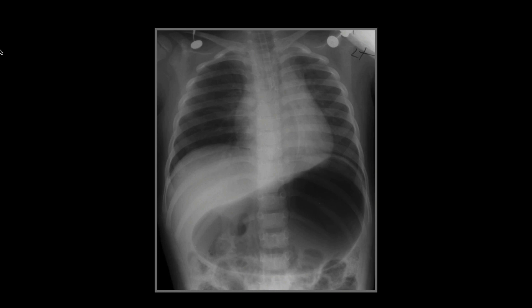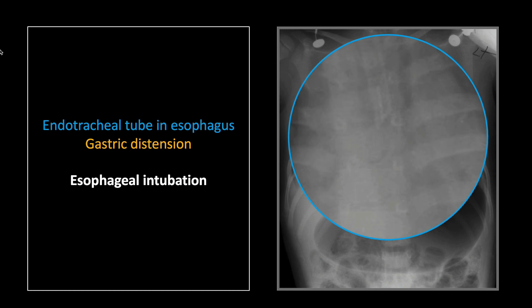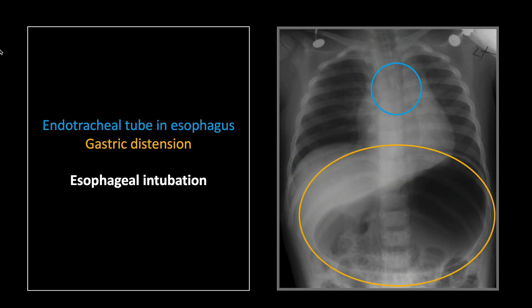Our next case is one of esophageal intubation — a relatively subtle case, at least as far as positioning of the endotracheal tube goes. You can see that the tip of the endotracheal tube does not lie directly above the carina; in fact, the entire tube does not quite overlie the tracheal air column, showing that it is in the esophagus, even though at first glance it might appear to still be in the trachea. Secondary findings are very helpful as well: there is extensive esophageal dilation and marked distension of the stomach, consistent with direct insufflation of the esophagus and stomach from this inappropriate endotracheal tube placement.